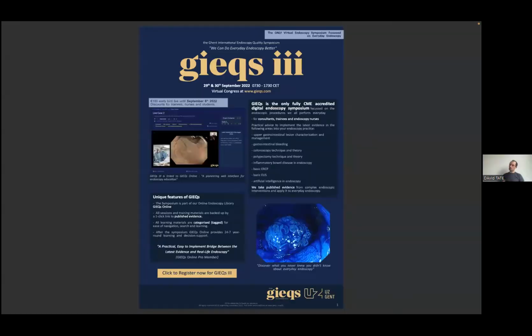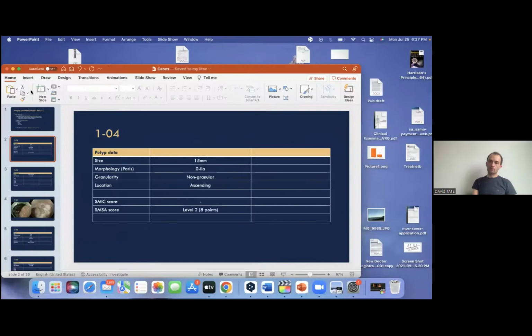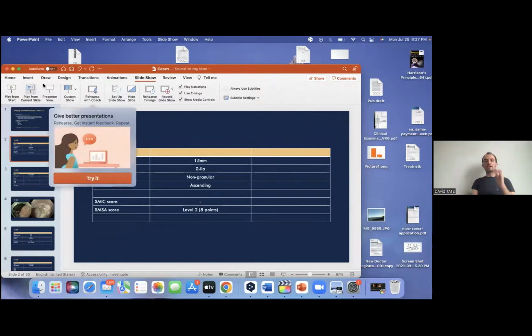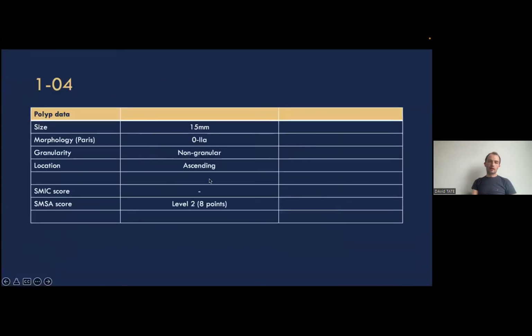Can I ask? Of course. So the edges of the polyp, to me, it looked like they were clearly demarcated. It might be that I joined late, so would you say that they are not? Okay, we'll go back to that in a second, but let's just let Vikash show his slide of the polyp, and then we will go back to that question, because that's an important question.